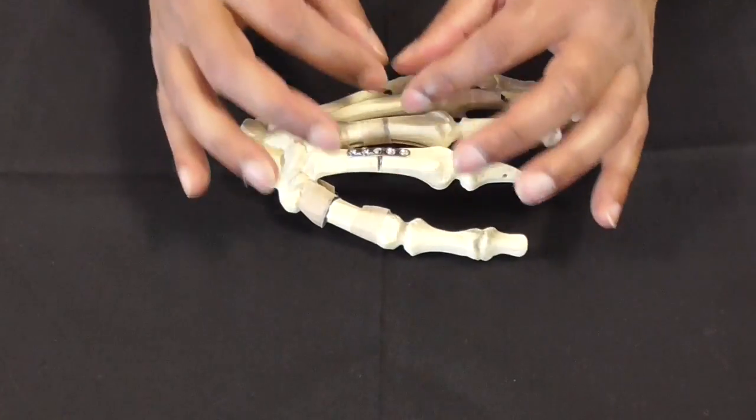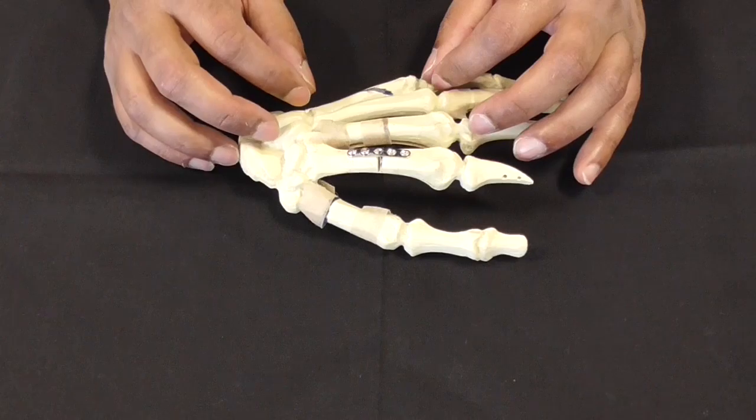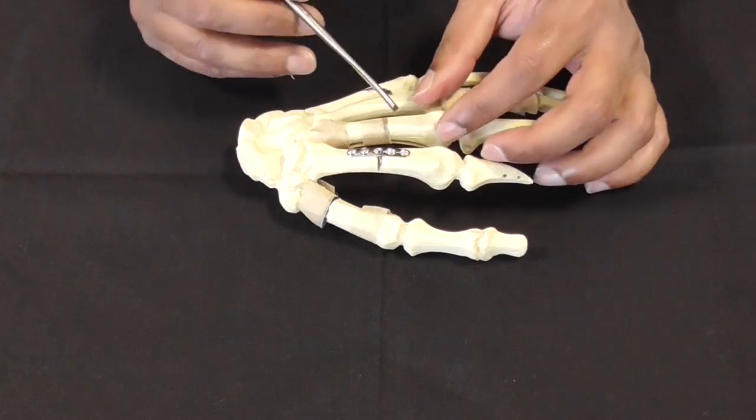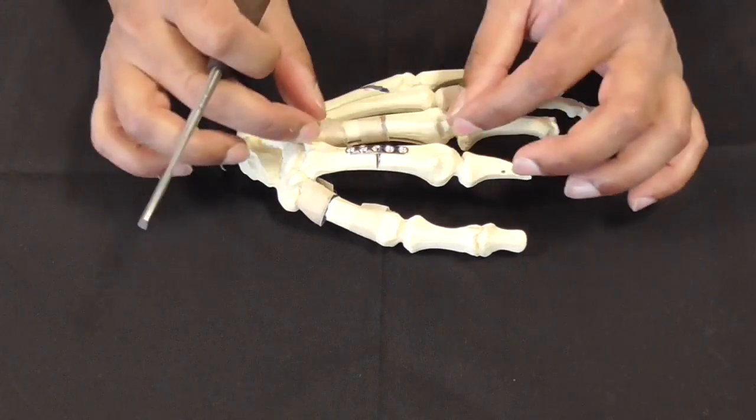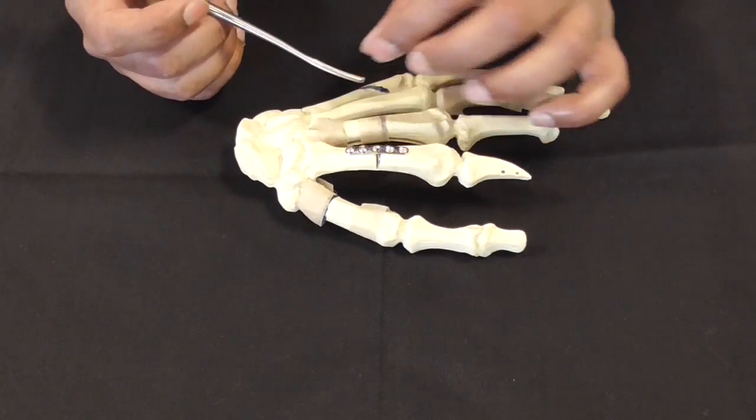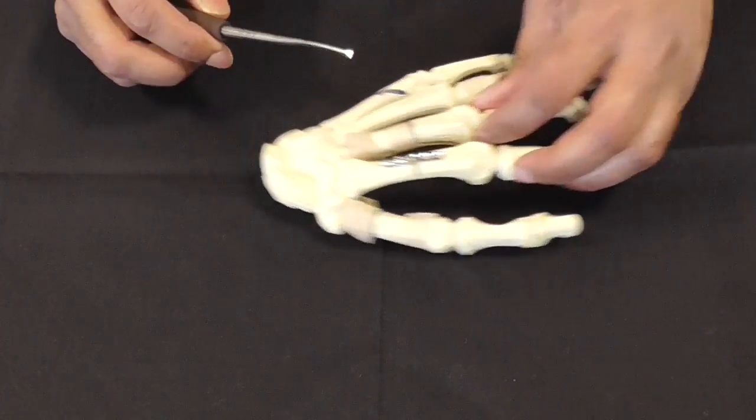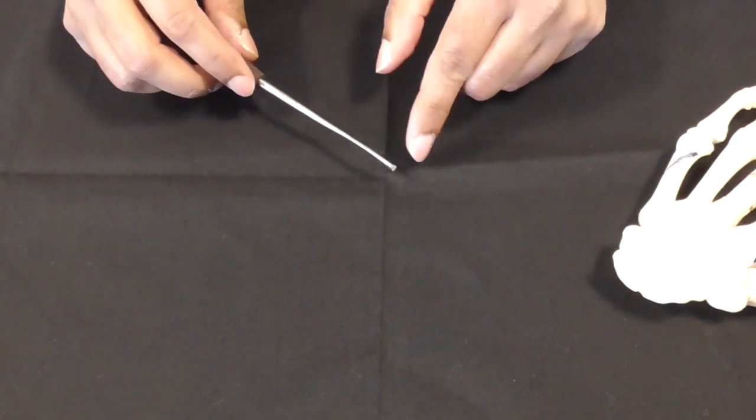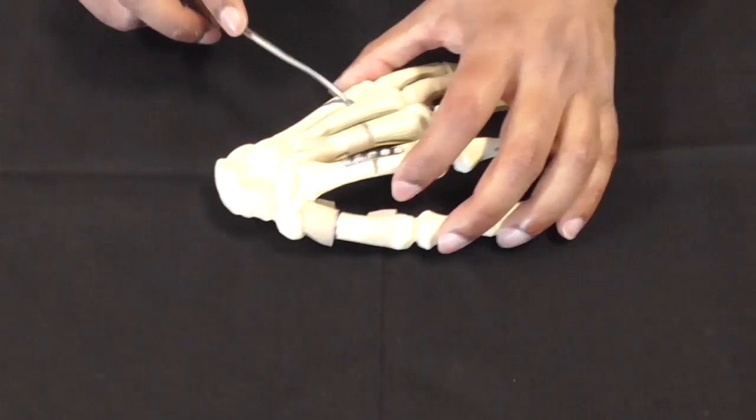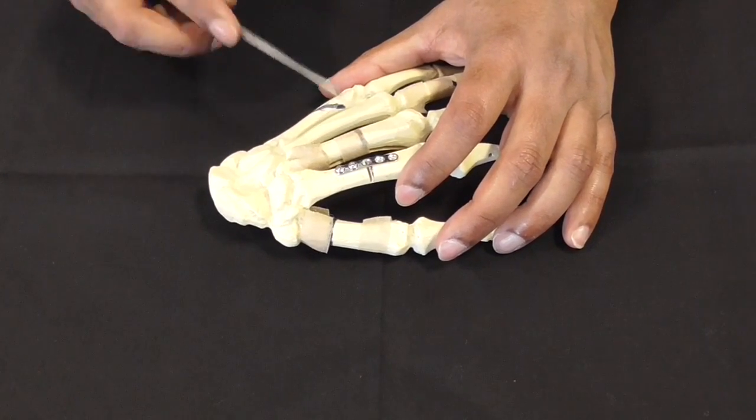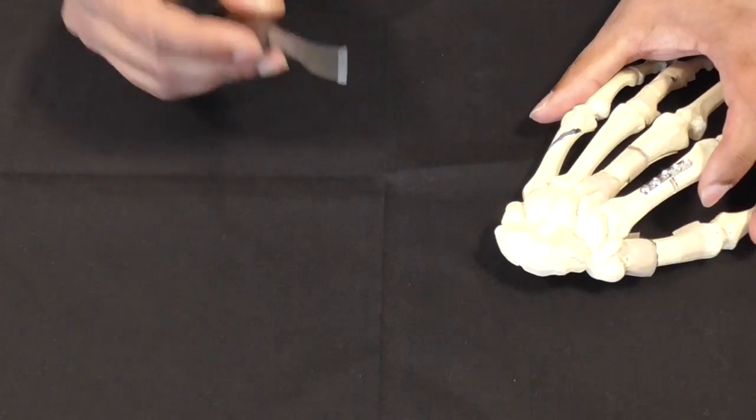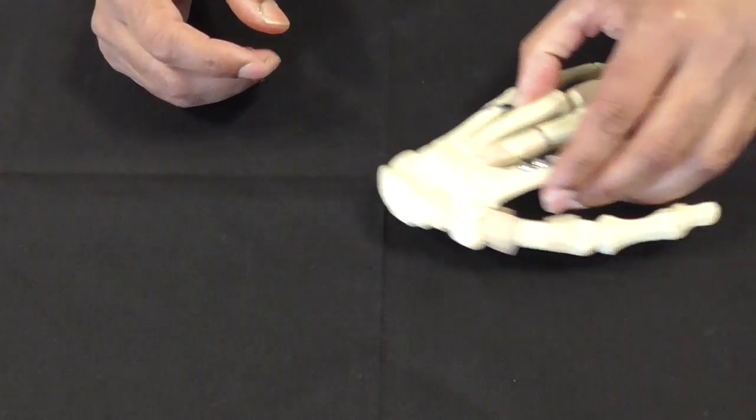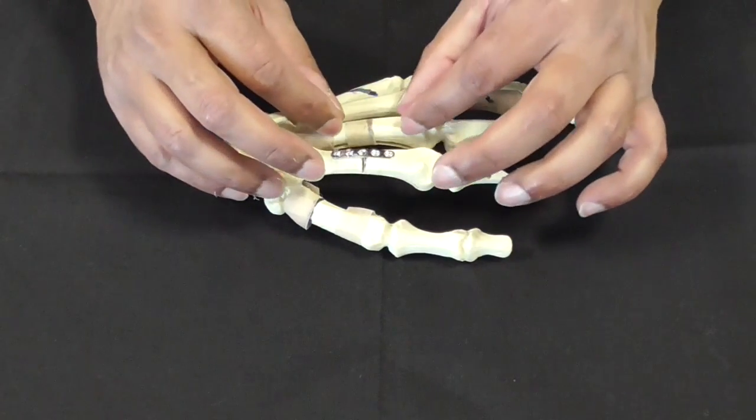Once you've got your fracture where you want it, before you put the plate on you want to take the periosteum off because you want to usually put the plate onto the bare bone. This is a periosteal elevator. It's got a sharp bit here and you raise the periosteum like that. So that's a periosteal elevator, lovely one with the wooden handle.